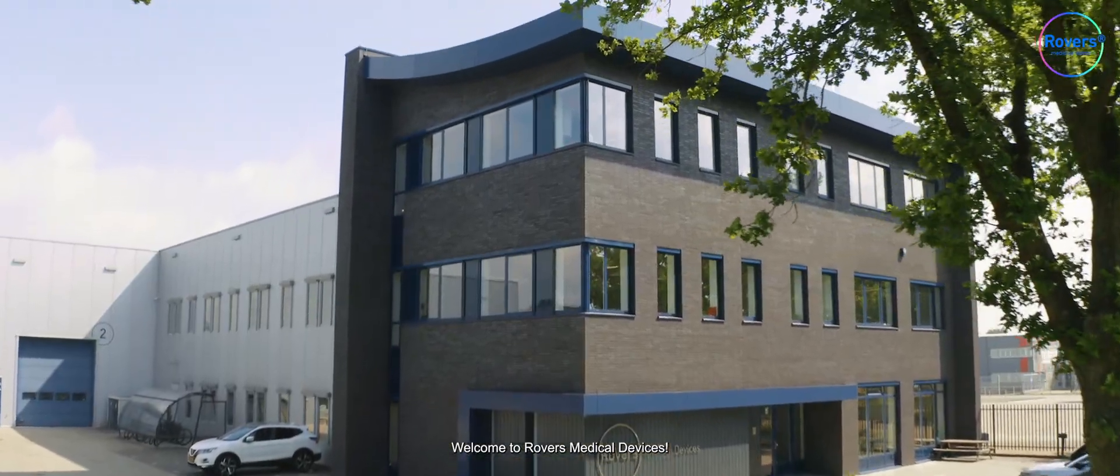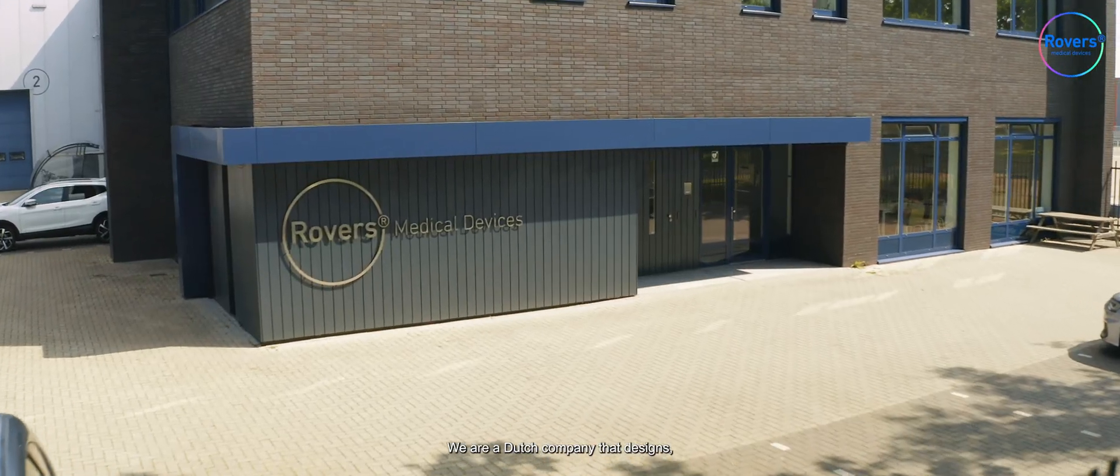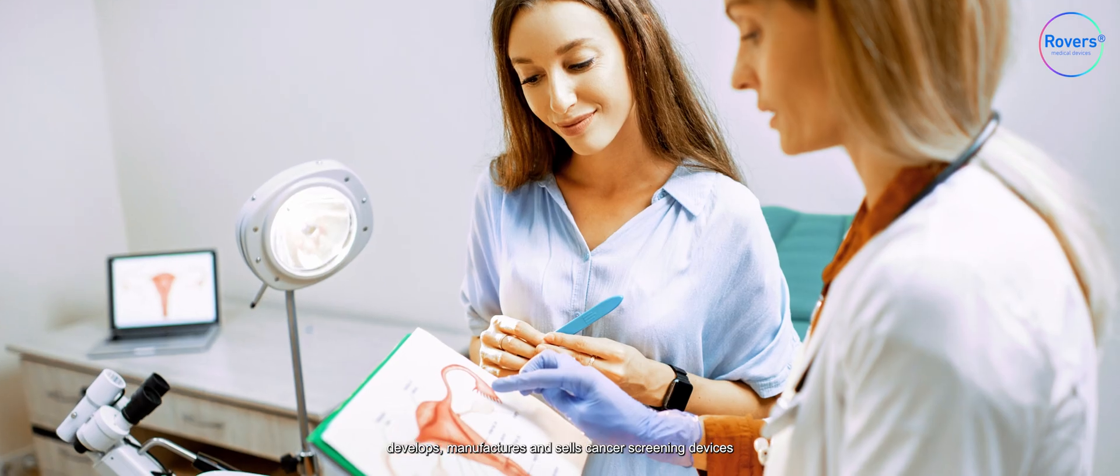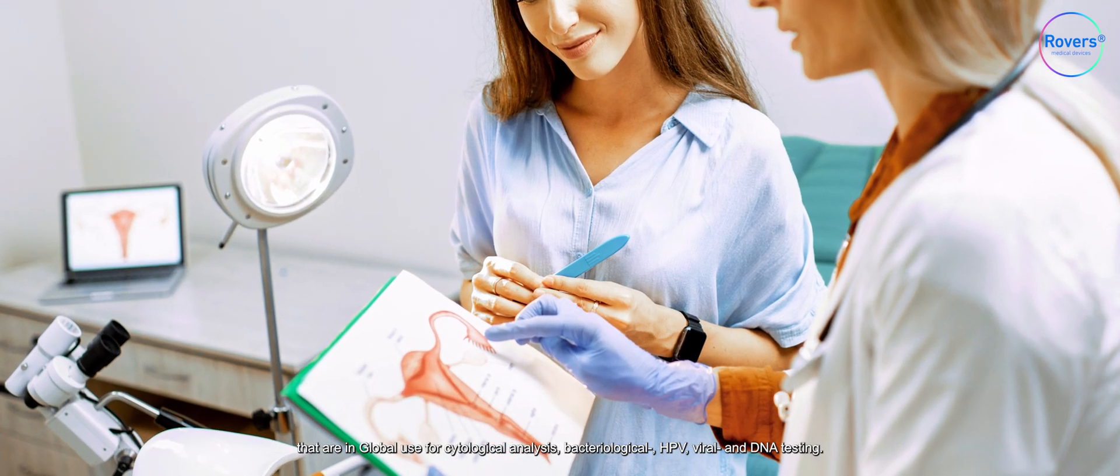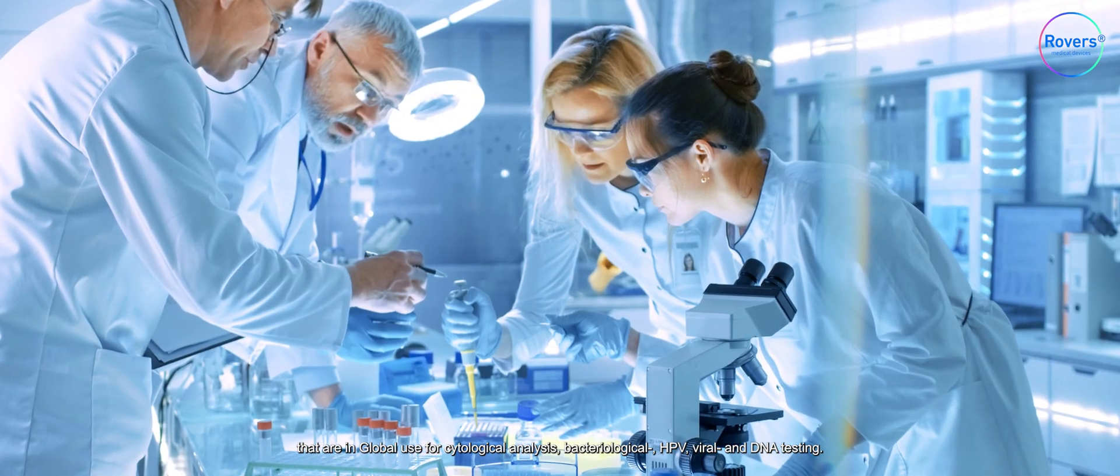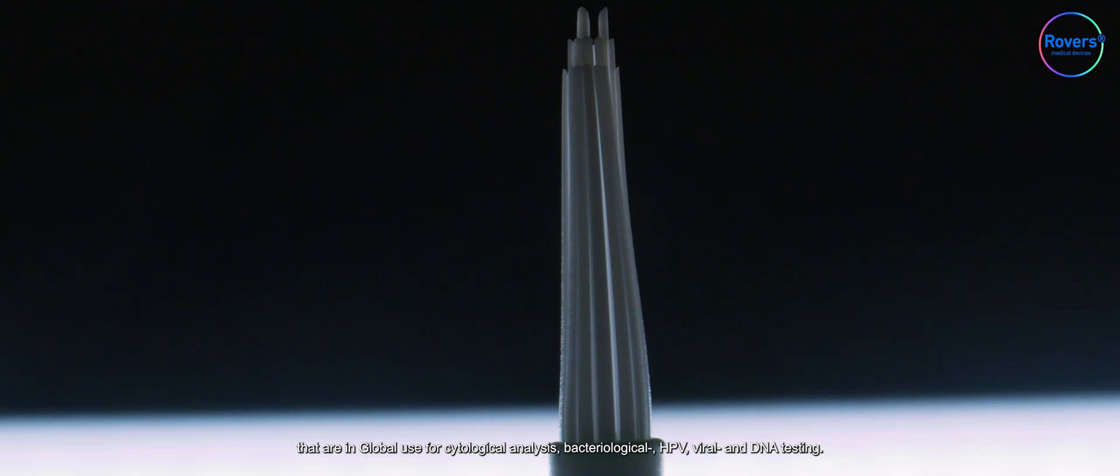Welcome to Rovers Medical Devices. We are a Dutch company that designs, develops, manufactures and sells cancer screening devices that are in global use for cytological analysis, bacteriological, HPV, viral and DNA testing.